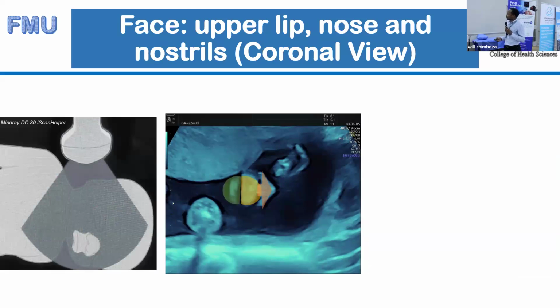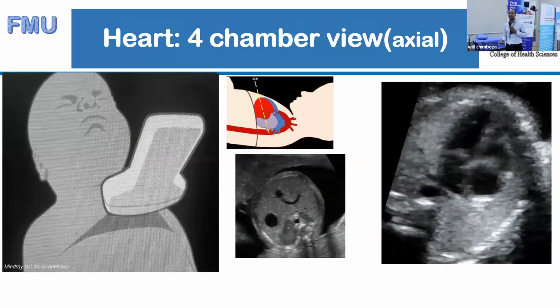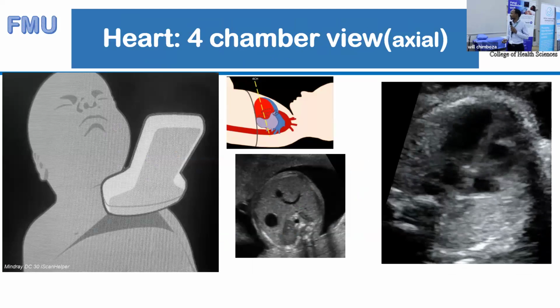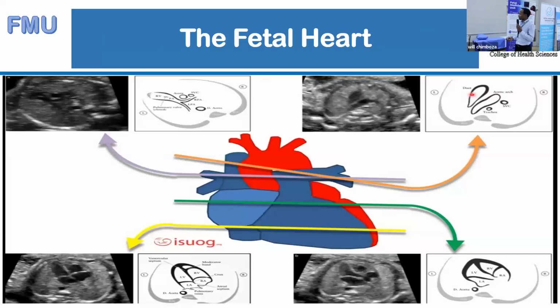Then from the fetal face, we go on and assess the fetal heart. So in terms of technique, I think Dr. Lerenga is going to demonstrate the technique in terms of assessment of the fetal heart. So the 4 important views that we want are the 4-chamber view, we also want the left ventricular outflow tract, and then we also want the 3-vessel view, and then the right ventricular outflow tract.